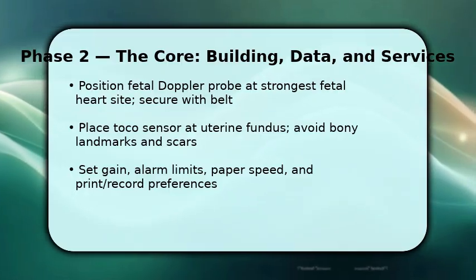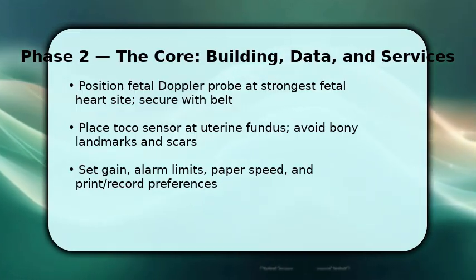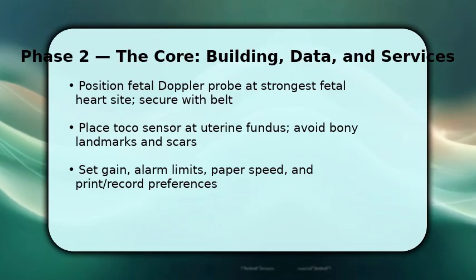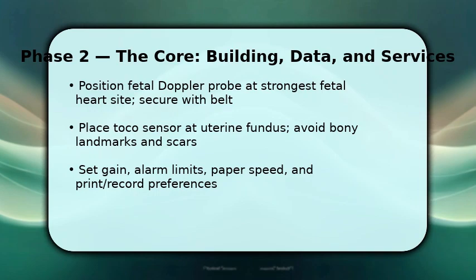Configure device settings. Set gain to avoid clipping, define fetal heart rate alarm limits, and choose paper speed or digital sampling. These choices affect interpretation and documentation.